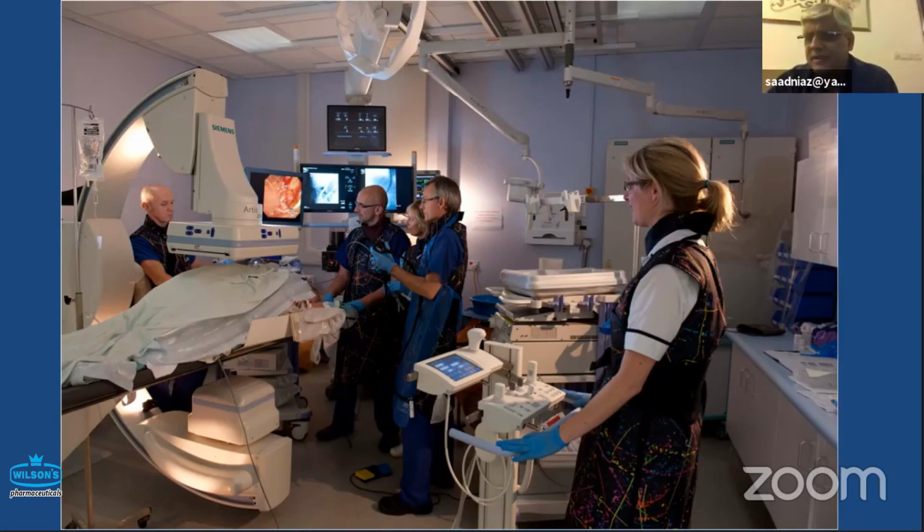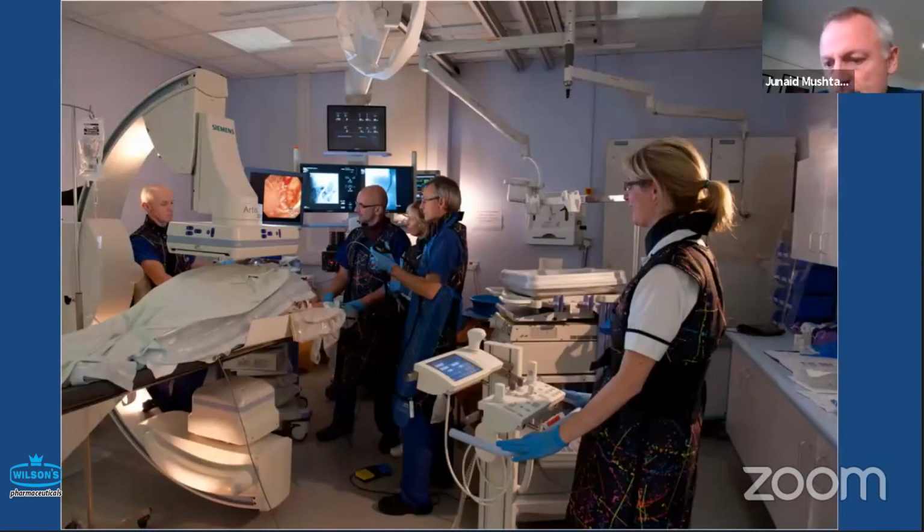And the point you very well made, the problems occur in patients who are actually incorrectly selected. And what happened with this patient was that this patient had problems and unnecessarily had issues. And I raised this point here that, and this is not a junior doctor, not somebody who just started, the point is that you need to stop yourself. The fact that you see the ampulla, you see a dilated CBD does not mean you always need to get in. Sometimes you can take, that was what I wanted to highlight.